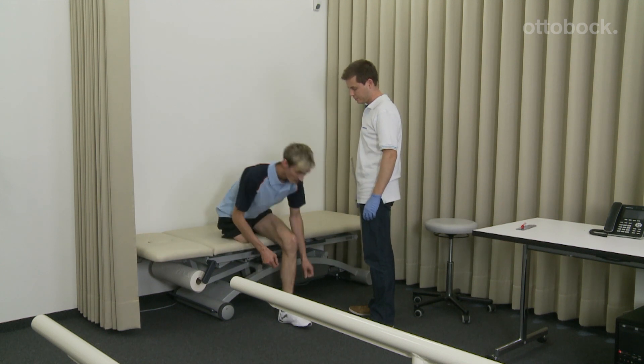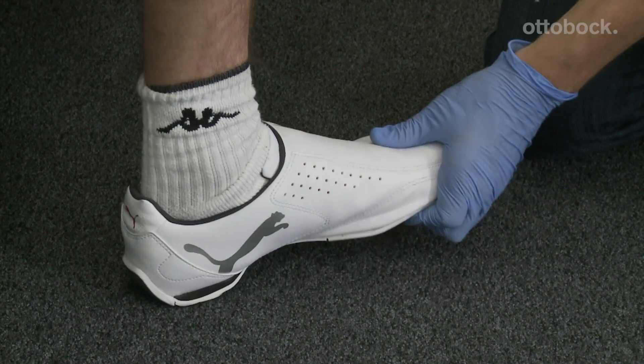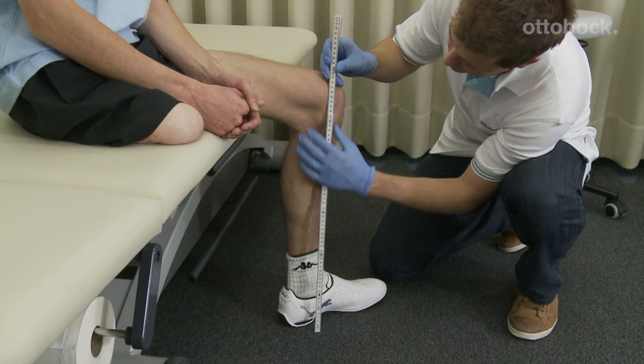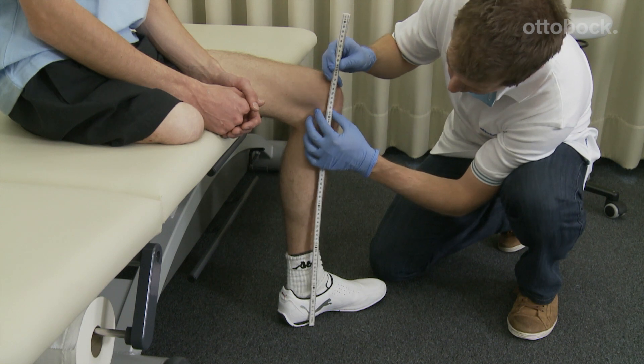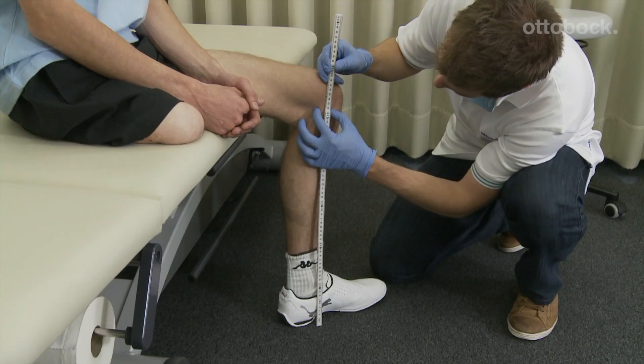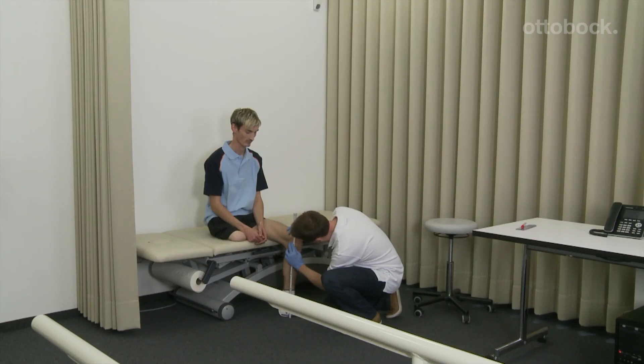The anamnesis of the runner starts with the determination of the knee axis position. Rotating the foot outwards makes the medial tibial plateau easier to feel. The height of the medial tibial plateau is now measured from the floor. Since no shoe is used for the 3S80, the height of the running shoe must be measured and taken into account as well.